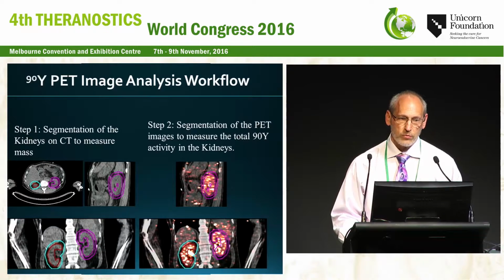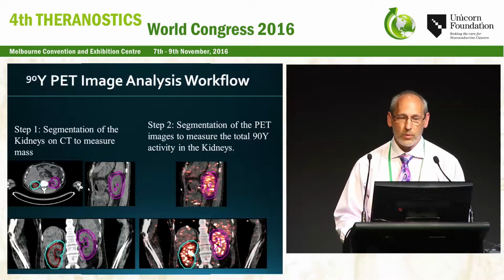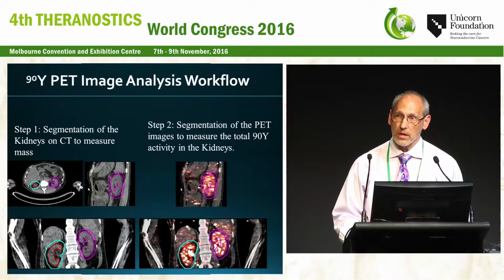Once again, nuts and bolts standpoint, this is the general workflow. Here's how we did the image analysis for the PET scan, the PET-CT. First, what we had to do was segment out the kidney.